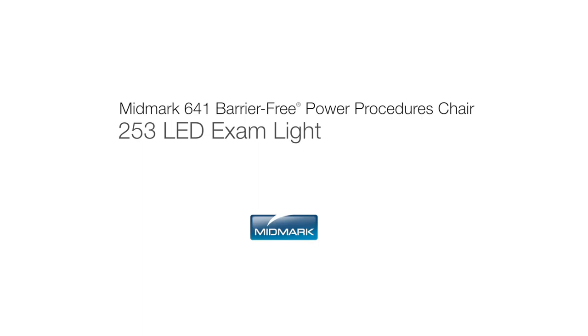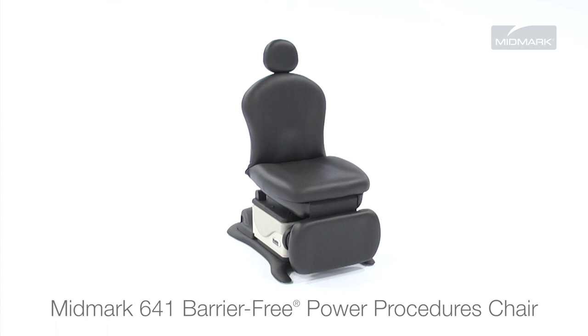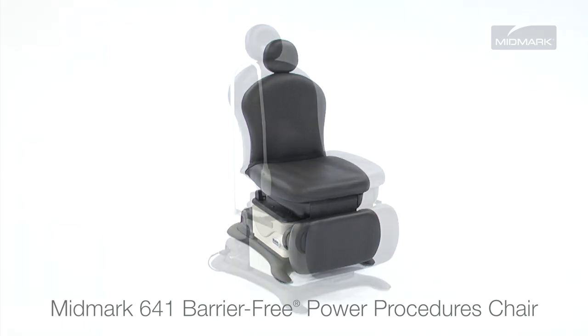This video is an overview of the Ritter 253 LED Exam Light accessory for the Midmark 641 Barrier-Free Power Procedures Chair. Always refer to the appropriate technical documentation for the complete list of installation requirements and instructions. The Midmark 641 Barrier-Free Power Procedures Chair is designed to be easily enhanced with a variety of accessories to fit your patient's and practice's specific needs.